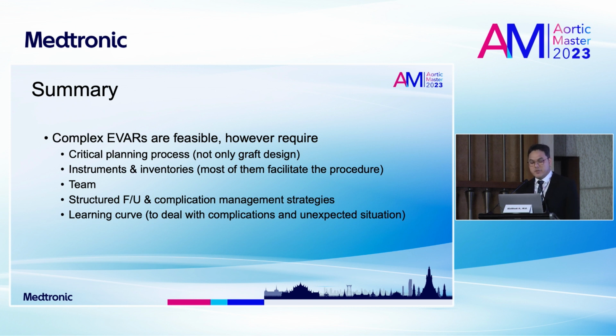You need a team to help you a lot in these complex procedures. You need a structured follow-up protocol and complication management strategies. And the most important thing will be the learning curve, not just to do the operation or implant the stent itself, but to deal with complications and unexpected situations that you may face later in the case.